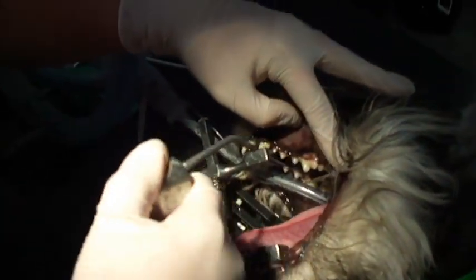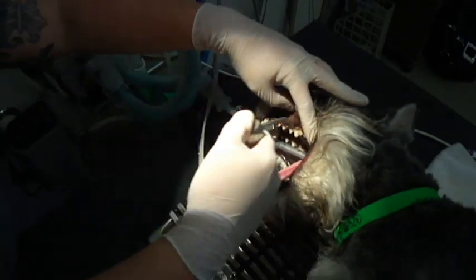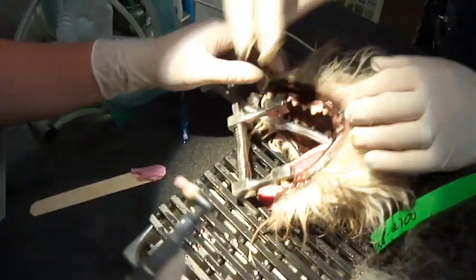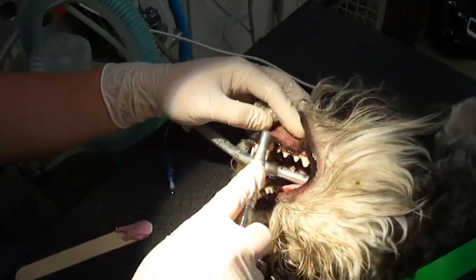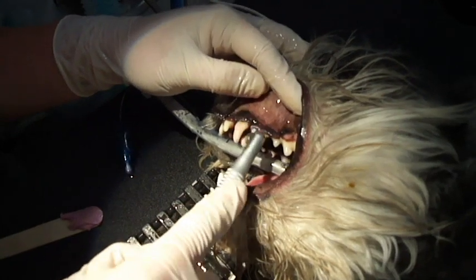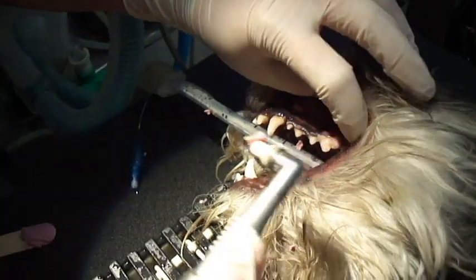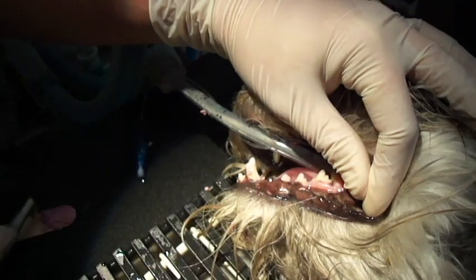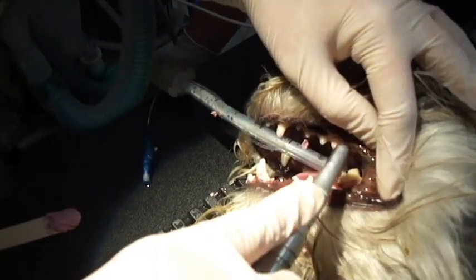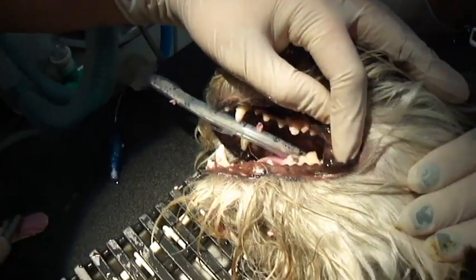Now I'm rinsing all the plaque out of the mouth before I apply the polish. Now I'm polishing all the teeth that I just cleaned, because you can't see but there are actually microscopic scratches on the teeth from the ultrasonic cleaner. It's very important that we polish these and get those off.